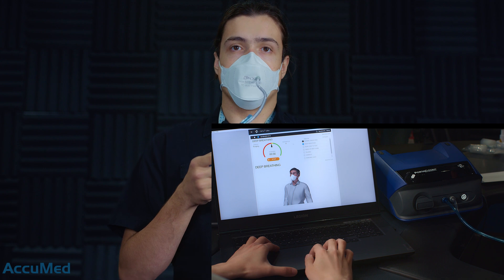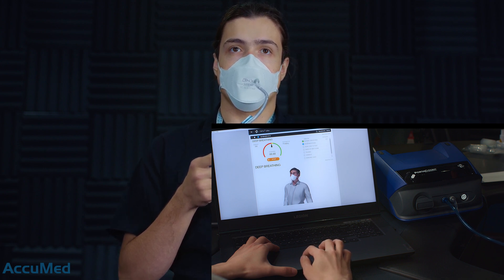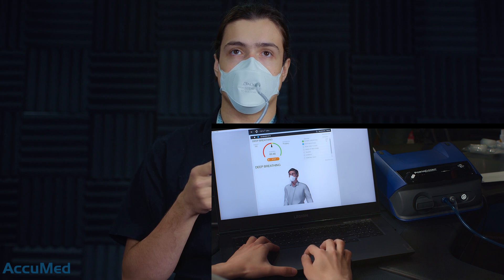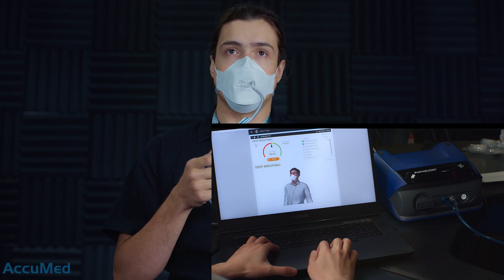Next exercise: deep breathing. Now we can see the results for the first exercise — we got a fit factor of 200 plus, which is really good. Anything above a hundred will be a pass.